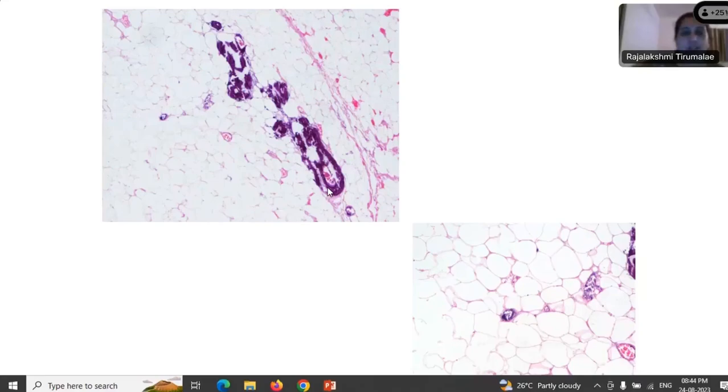And of course, we did do a special stain. Oh, I shouldn't have labeled the stain. So this was a von Kossa stain, which beautifully highlighted the calcium in the vessel walls, right? Now, one point here, you need to see calcification for calciphylaxis.